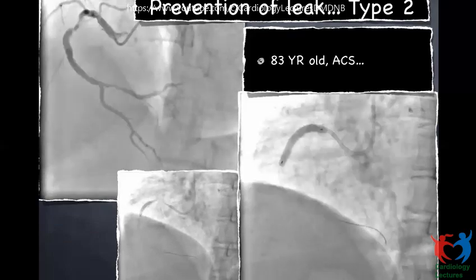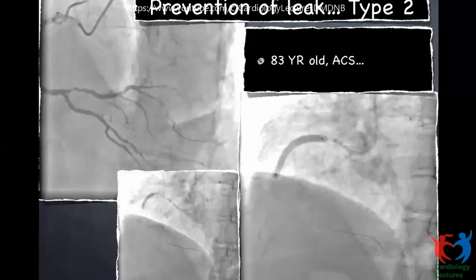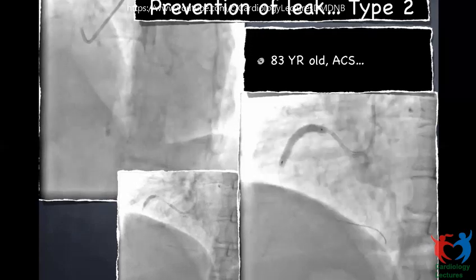Coming back to Type 2 — how to prevent the leak. This was an 83-year-old gentleman with an acute coronary syndrome and a calcified right coronary artery. Our plan was to open up the proximal and distal vessel. We started with a 6 French guide catheter via the radial approach, using a short Amplatz catheter which provides better support and helps avoid dissection. We dilated with a 3 mm balloon — the vessel opened up well — and used a 4 mm, 38 mm stent to deploy at the proximal segment.